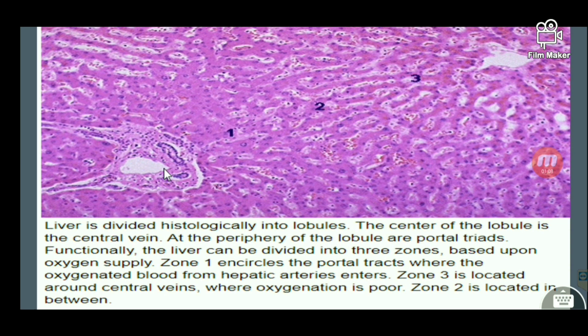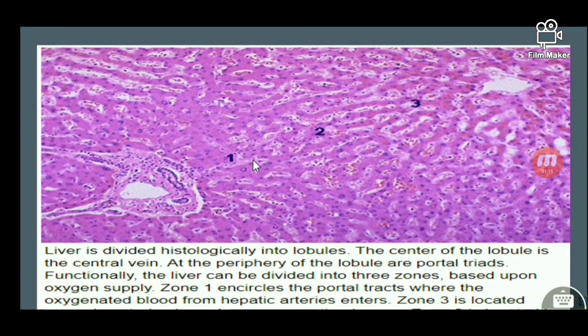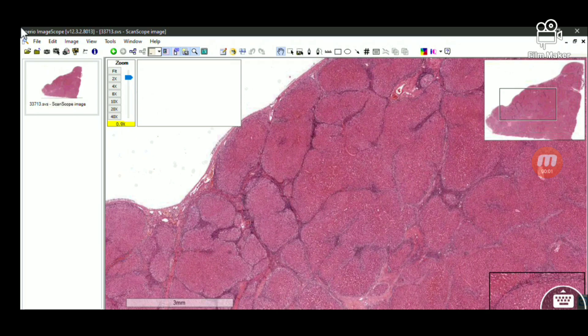The portal vein brings in blood from the GIT, which is nutrient-rich, and the hepatic artery brings in fresh blood which supplies the liver. The hepatocytes, or cells of the liver, are arranged in the form of cords. These hepatocytes are lined by sinusoids — small blood-filled channels that travel from the portal tract to the central vein, where exchange of nutrients and removal of metabolites takes place.